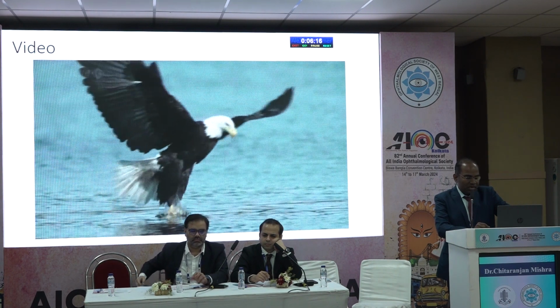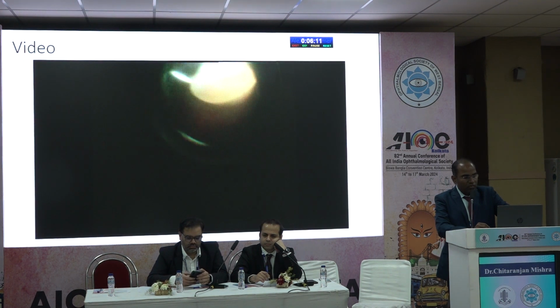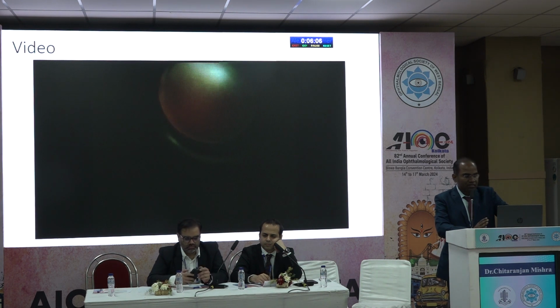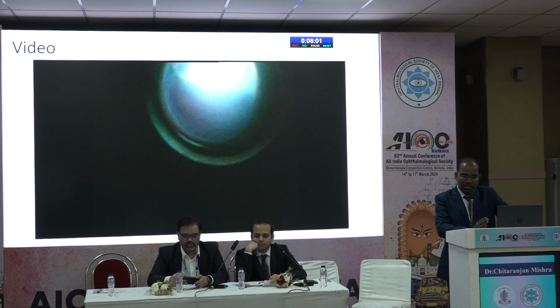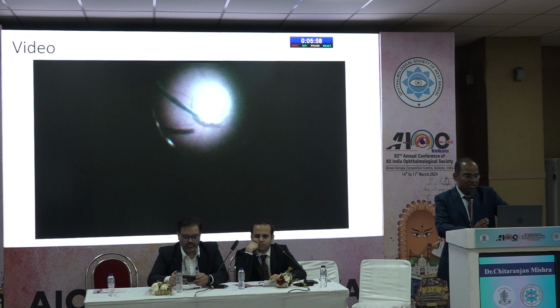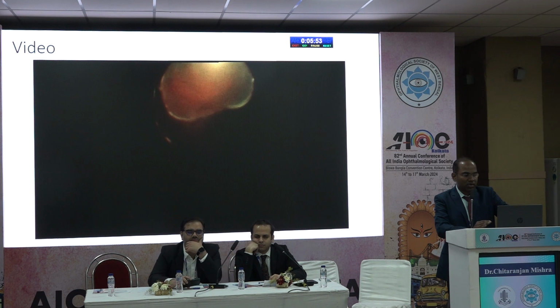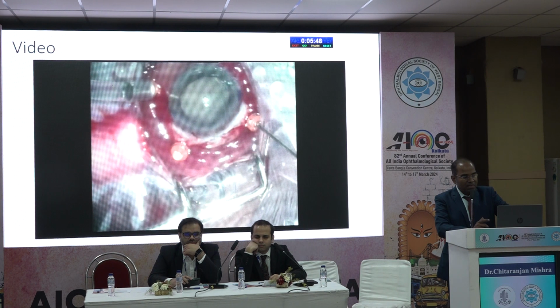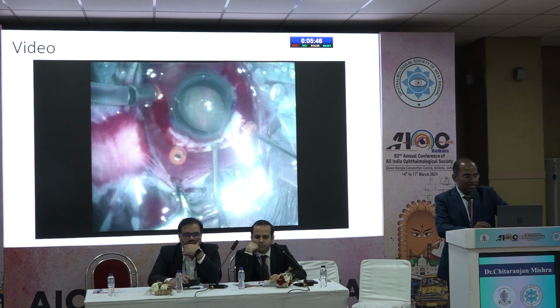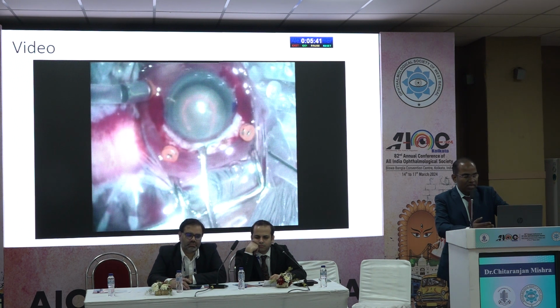Then why I have shown this video, just like the eagle is lifting the fish, similarly you have to go below with the vacuum of the vitrector, maximum set 600, 650, whatever is there, lift it, bring it up and hold it with the vacuum only. It dropped once, but here comes why I have not induced the PVD, because that vitreous sheet acts as a cushion there. Then in the second attempt I am successful, and I am holding it in the pupillary plane without injuring the iris, insert the wire vectis, and it's just like SICS, the nucleus extraction.